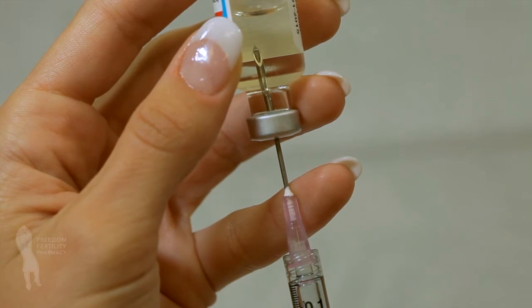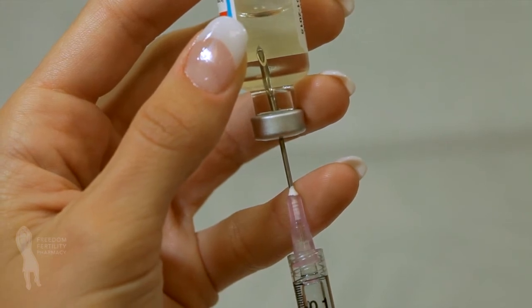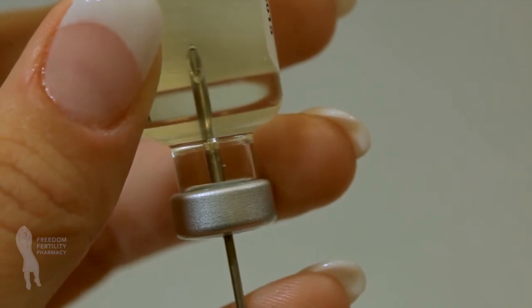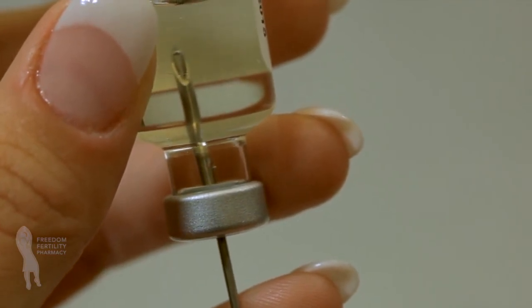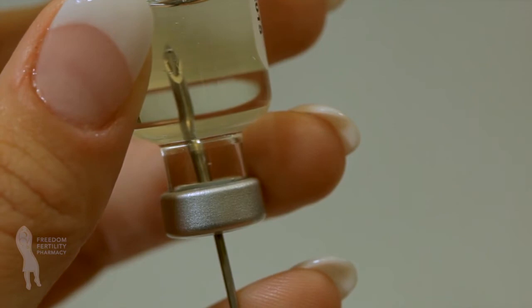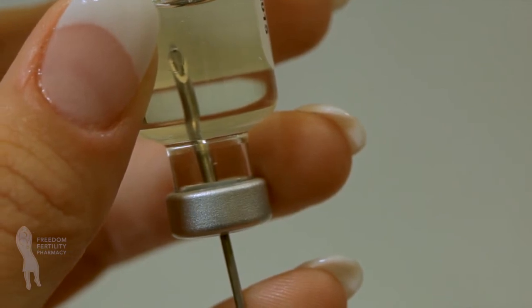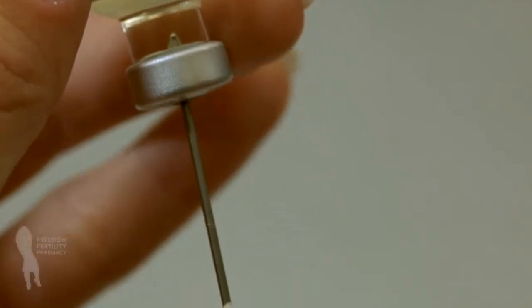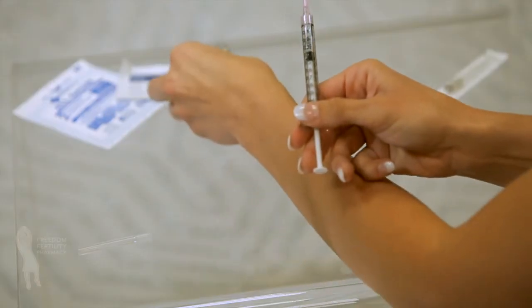Make sure the tip of the needle remains in the liquid by slowly backing the needle out of the vial as you withdraw the solution. You will only be using a portion of the medication for each injection, not the entire vial. Do not touch the needle. Remove the needle and syringe from the vial.